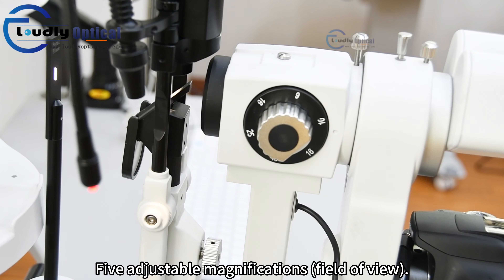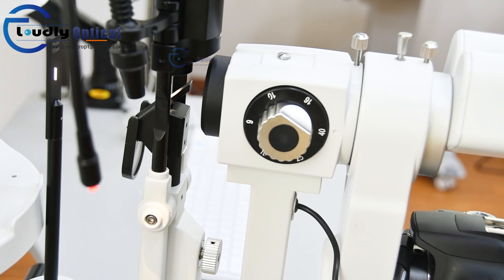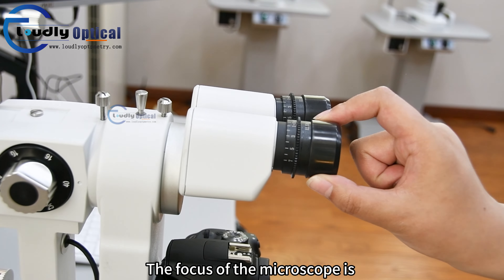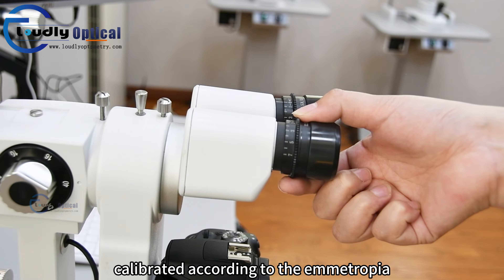Five adjustable magnifications are available for the field of view. The focus of the microscope is calibrated according to emetropia.